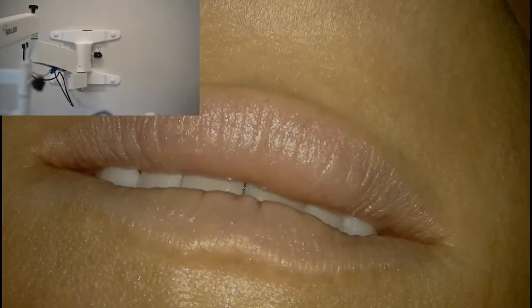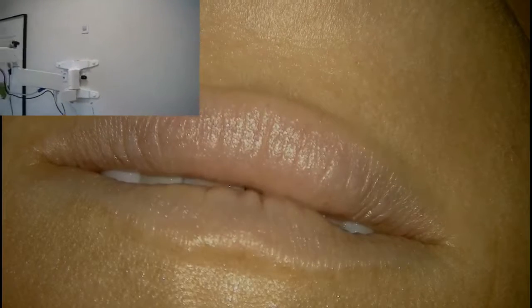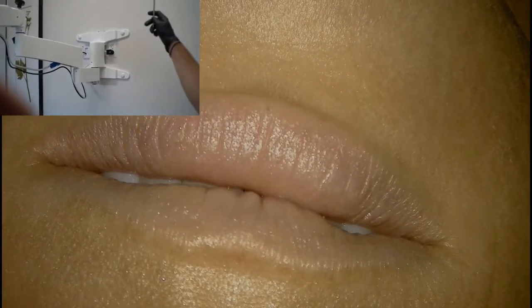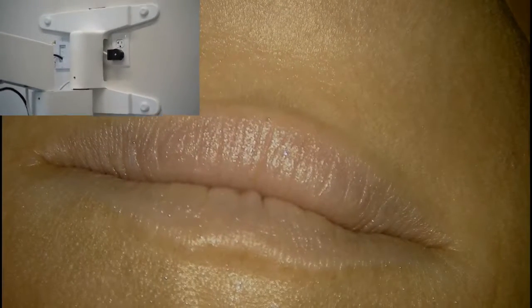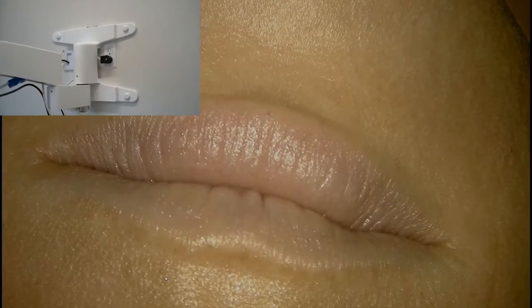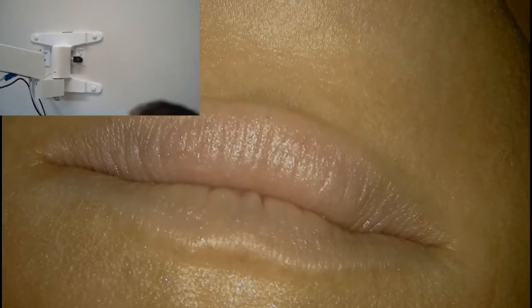The high mount obviously is high, and sometimes just for where the room position is, you'll put it up really high up here. And then it has a swing arm that comes down, so when you're sitting, it's at arm reach to where you can grab it and bring it over. And I think that's how the mount goes on the wall.